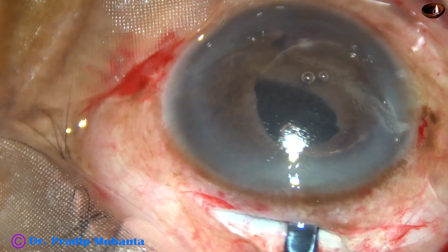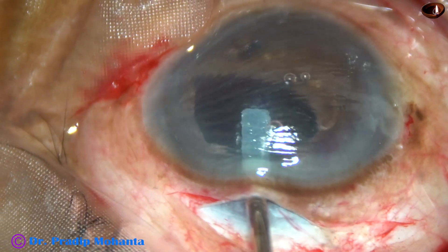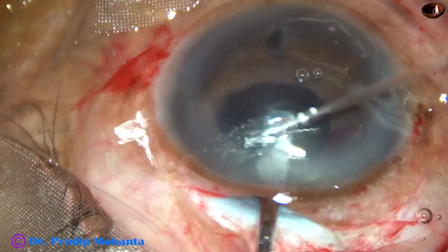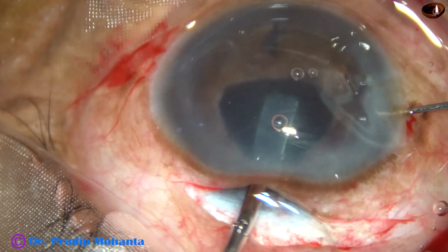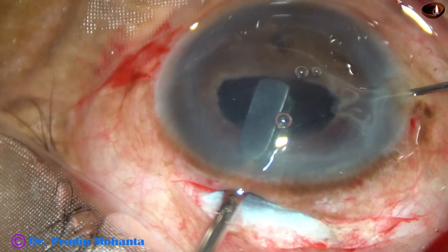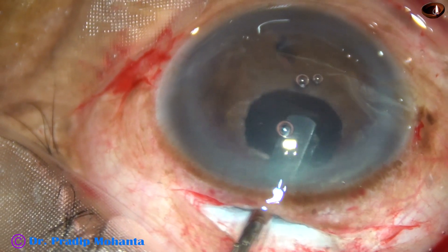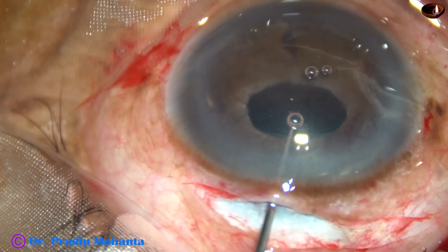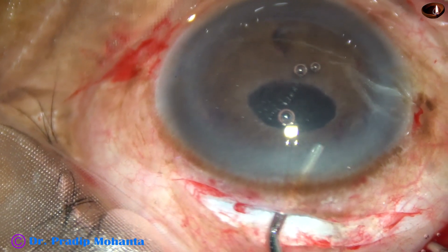And now I hold the lens with the left hand. The tucking instrument — a Szynski hook — comes to the right hand. This haptic is enclaved nicely. I lift the lens, tuck the lens, and it goes behind the iris. Some more viscoelastic.